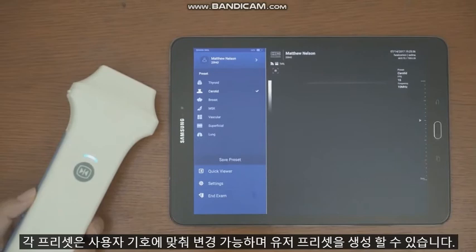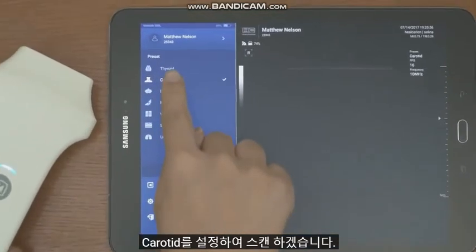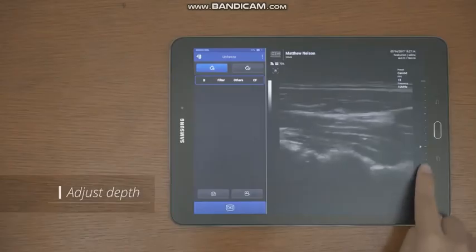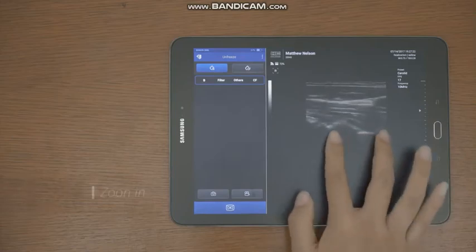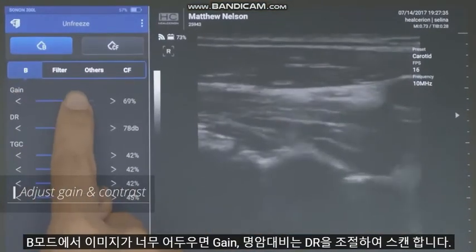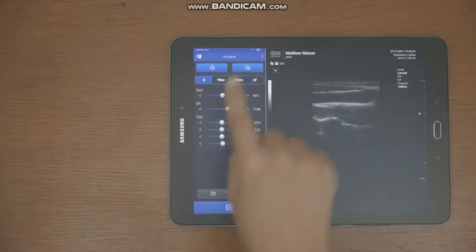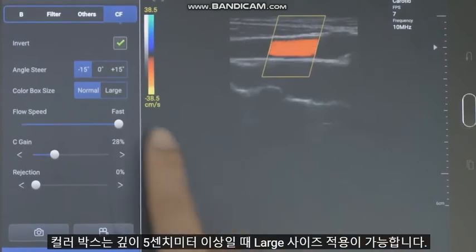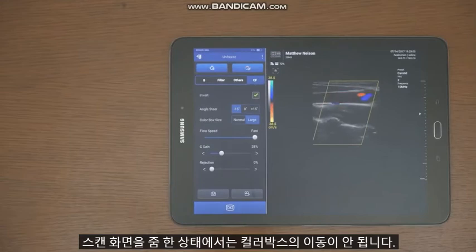Each preset can be changed according to the user's preference, and user presets can be created or modified. For example, you can set it to carotid and scan. You can adjust the depth by dragging the bar, and the focus moves when you tap on each part. You can also zoom in on the screen. If the image is too dark in B mode, adjust gain and contrast using the DR setting. Tap the CF button to view the Color Flow Doppler image. The color box is available in large size when the depth is over 5 cm. Note that the color box cannot be moved while the scan screen is zoomed in.